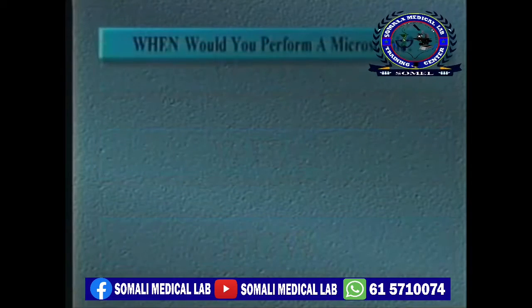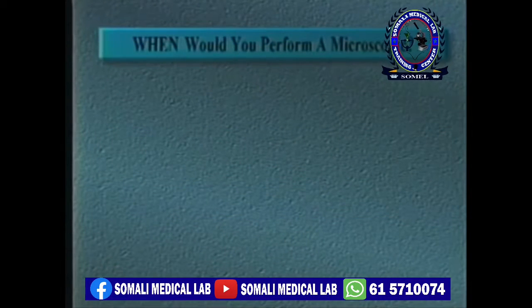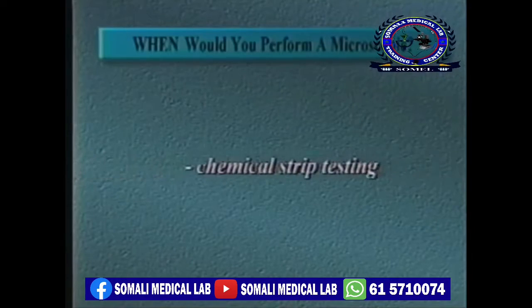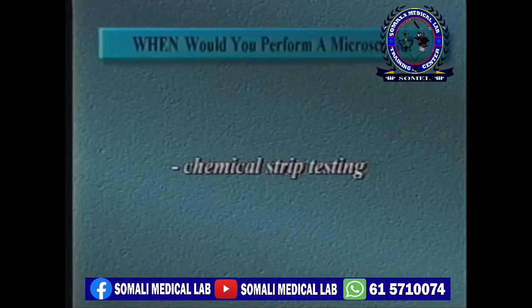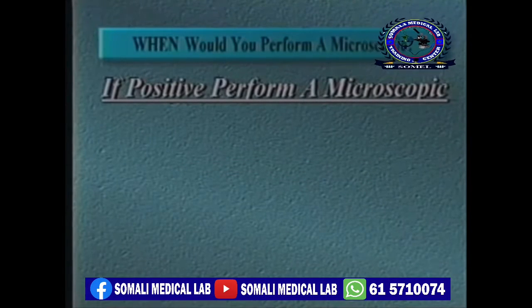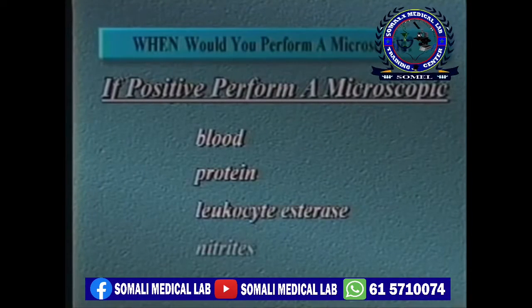The when of performing microscopics is an important issue in today's busy laboratory. Microscopics should be performed only on those urines that have been screened macroscopically. To properly screen macroscopically, a dipstick with all the chemical tests should be used. If the chemical testing is positive for any of the following list, then a microscopic should be performed. These chemicals are blood, protein, leukocyte esterase, and nitrites.